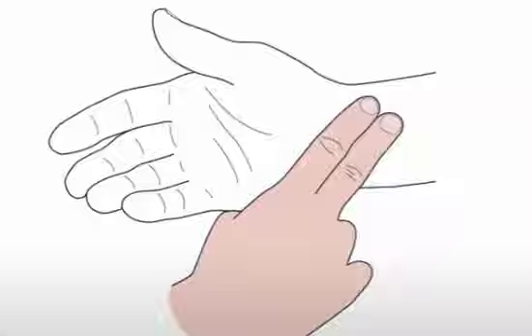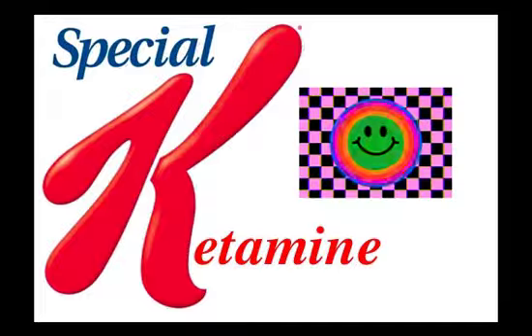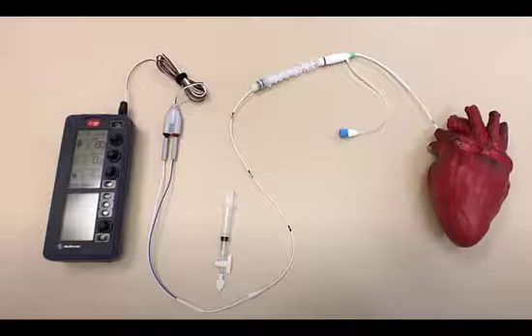Check the patient now has a peripheral pulse and reasonable blood pressure from the newly increased heart rate. And whilst the patient's enjoying the IV ketamine, which you can top up as required, head off to the cath lab for a transvenous pacemaker. Done.